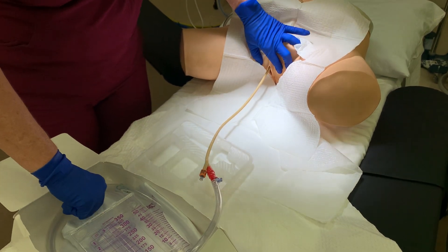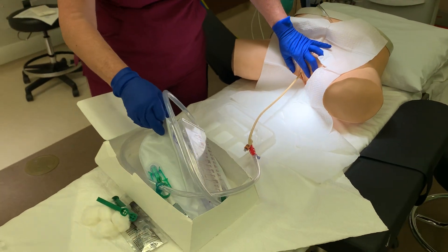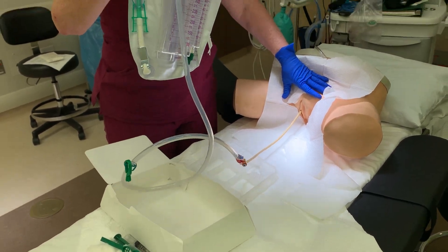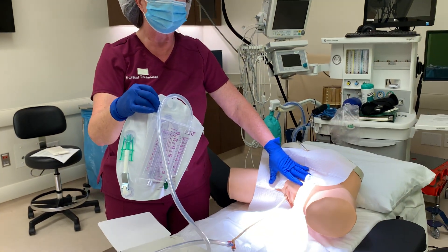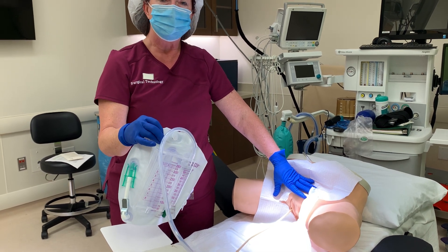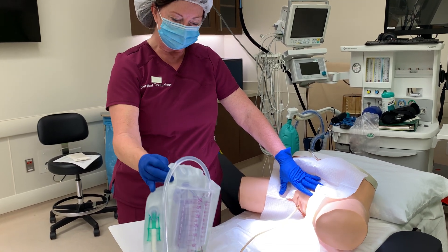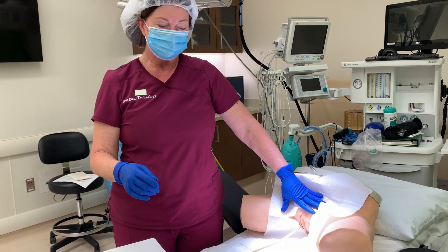Now we can break all of this down. This Foley bag will then be placed under the female's right or left thigh, and then it will hang on the bed up by anesthesia, because anesthesia needs to monitor the urine output. And that is a female urinary catheterization.